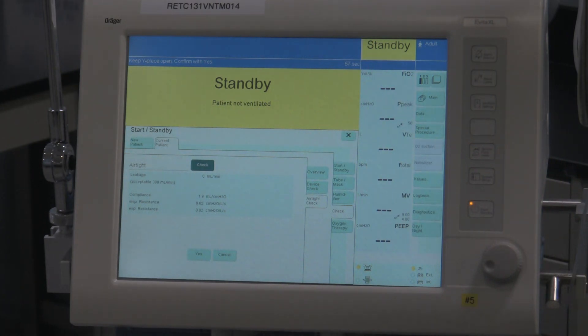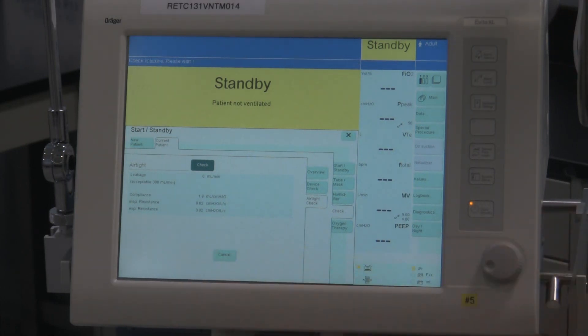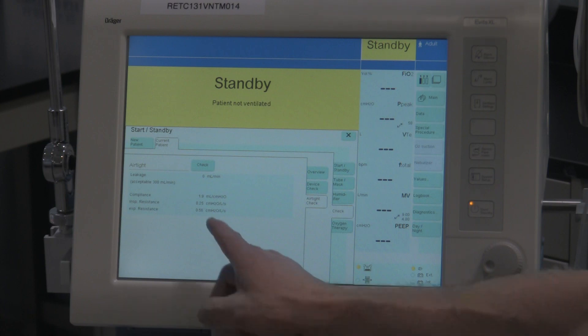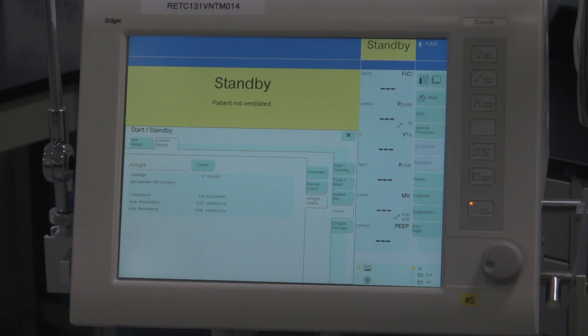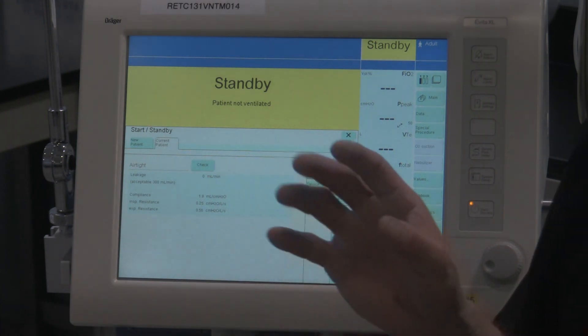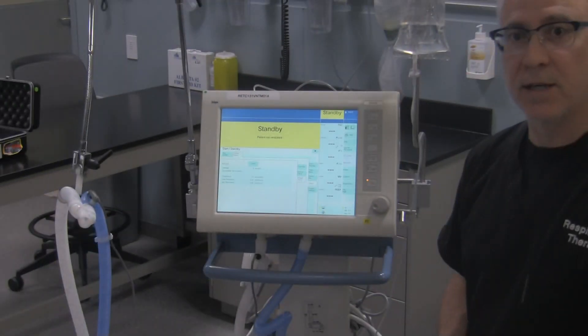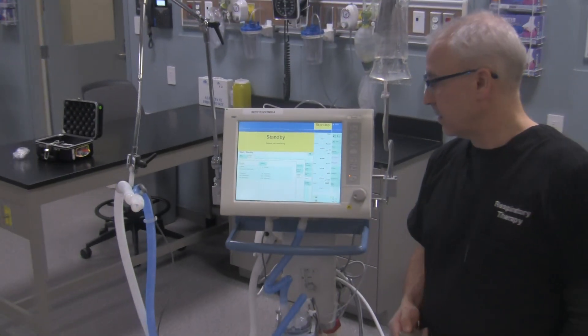Now it says 'Keep Y piece open, confirm with Yes.' So we're going to simply take this plug off the circuit and hit Yes. It says 'Check is active, please wait.' And it's done — it doesn't explicitly tell you that it's done, but it is in fact done. It tells us the compliance of the circuit is 1.9 mils per centimeter of water and that there is no leakage — zero mils for leakage. So this ventilator circuit is tight, it is good, and there are no leaks on our system.